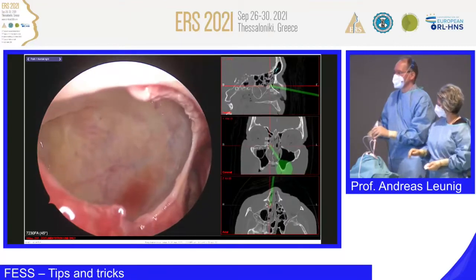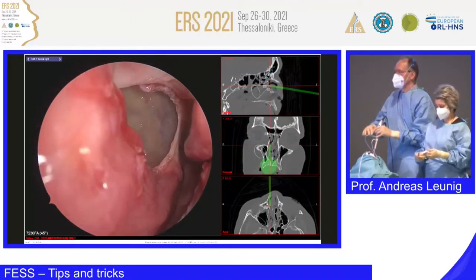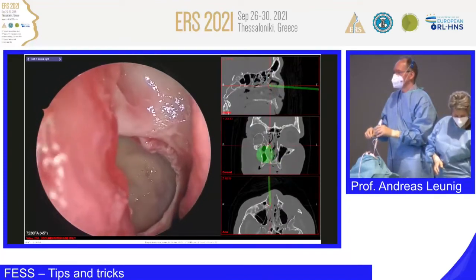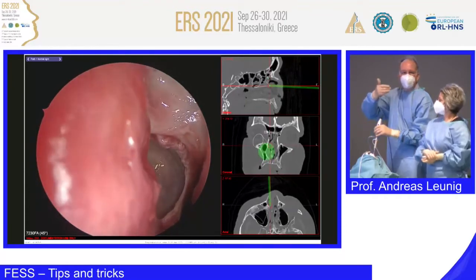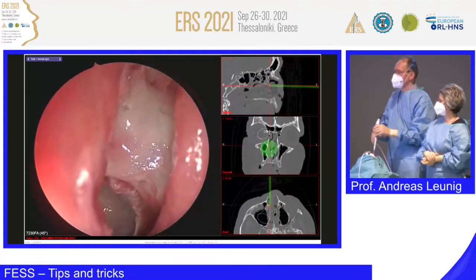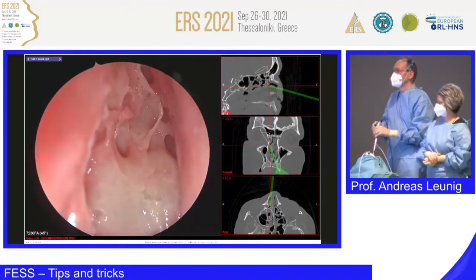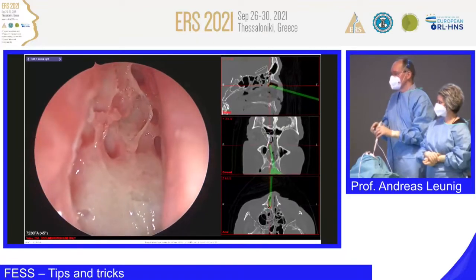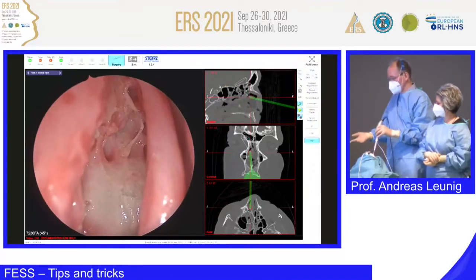So, well, this so far, how we deal after resecting the uncinate process, leaving the first basal lamella intact as a remnant for navigation by anatomy. We are facing the ethmoidal bulla, and now we are looking up to the frontal sinus. And I'm not definitely sure, but I would like to check it with navigation. Mrs. Hartmann, please, that's your part.